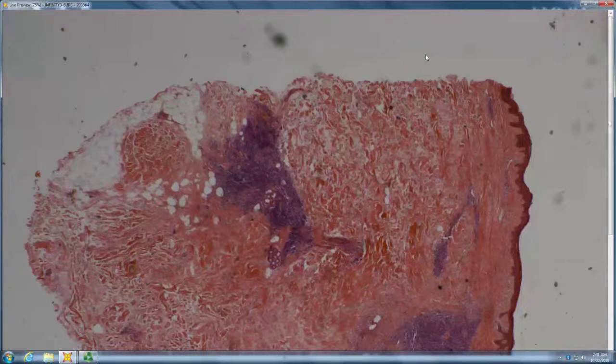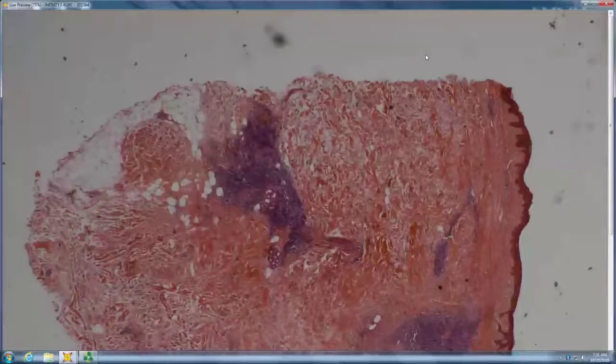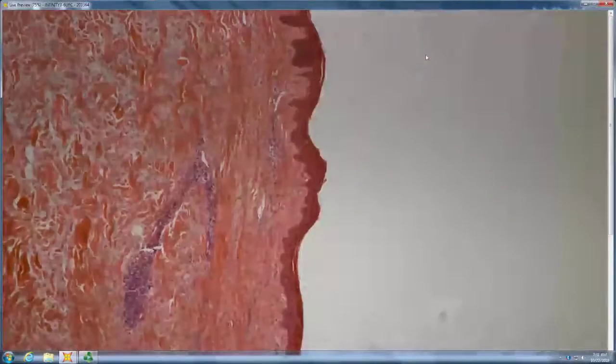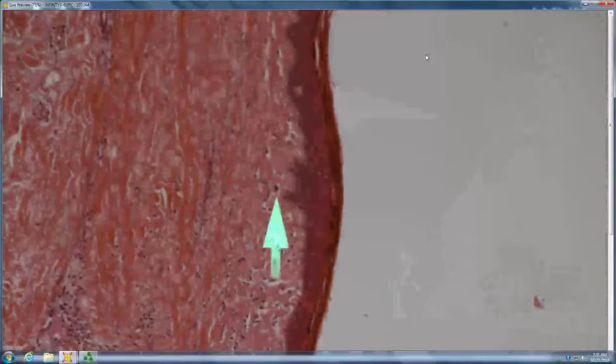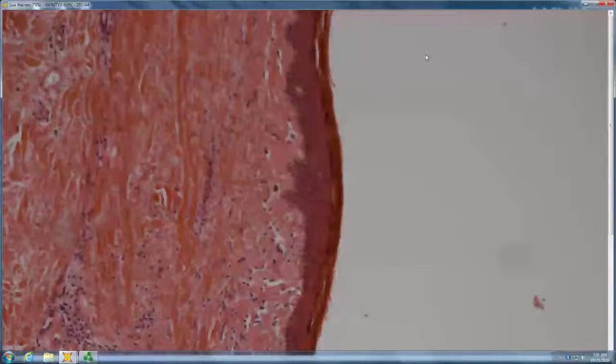Yeah, and we always say connective tissue because you can't tell histologically if it's lupus or dermatomyositis, and sometimes there's even overlap with morphea. Here I don't see any interface or mucin deposition, so I think it can be inflammatory morphea in this case, but it could probably be any. And there is a little bit of pigment incontinence, so maybe there was some interface change.